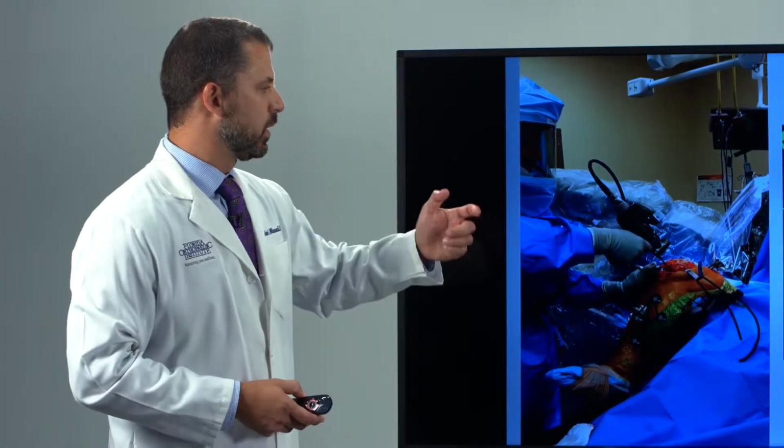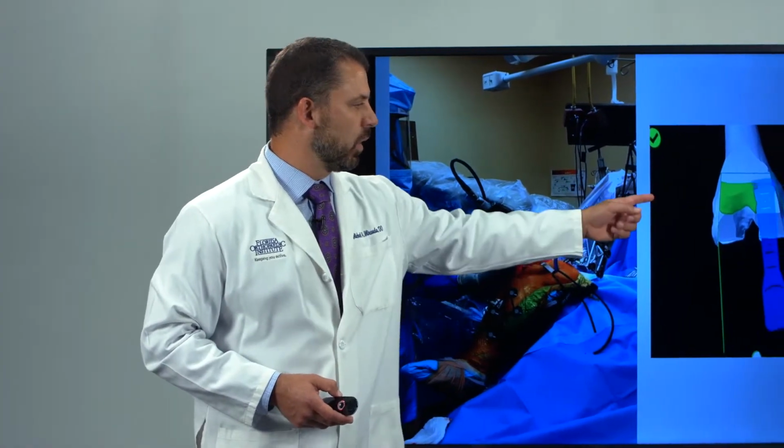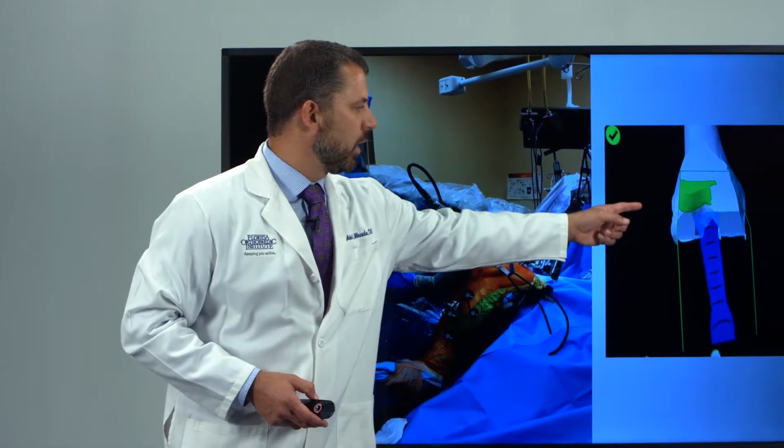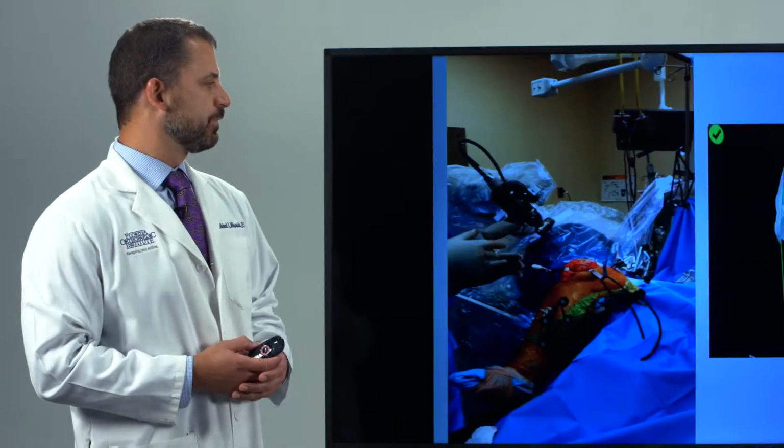This is another view. You hit the button. Once you're green, that means go, and then you can hit the button again and you'll go and resect the green area. Once that's completed, that portion of the resection is done.